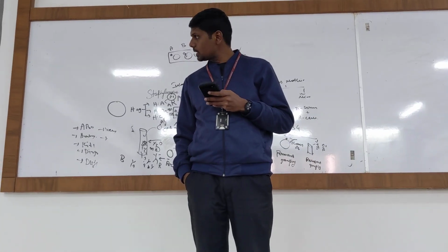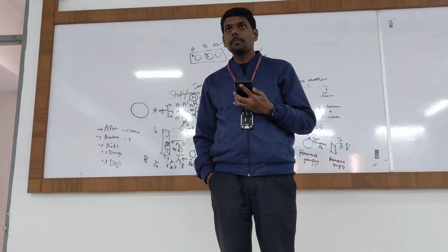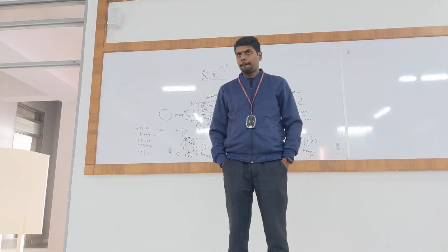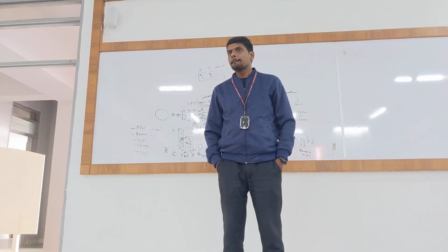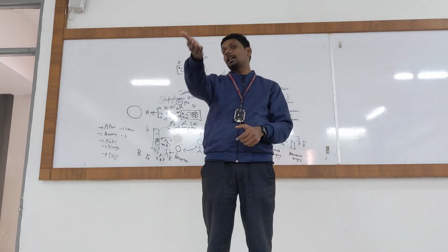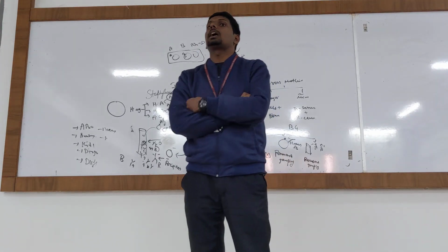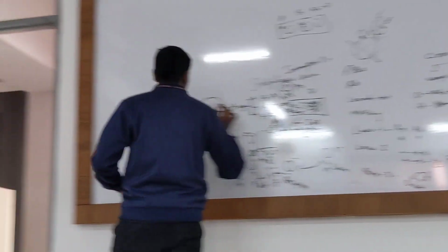Do you have the answer there? Yes, sir. What is it? Complete antibodies can cause agglutination of antigens. Incomplete antibodies cannot directly agglutinate antigens. They need a second step. They require tests like the indirect Coombs test to detect their presence. Very good.